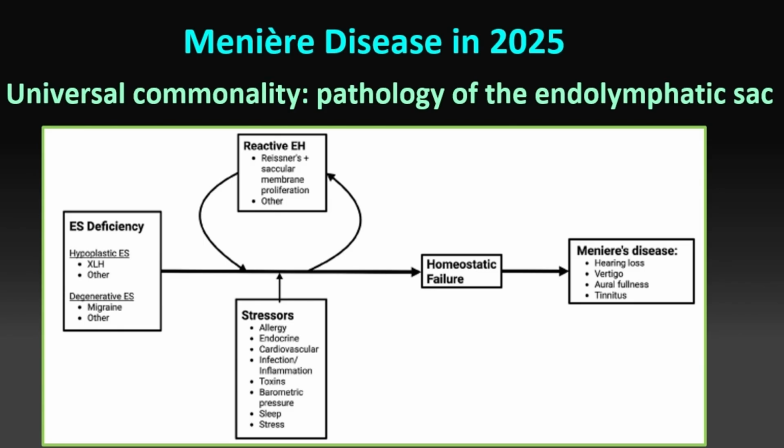Is it the endolymphatic sac hypoplasia type, or is it the endolymphatic sac degenerative type? So that's now how we diagnose Meniere's and give a little bit more about the underlying phenotype on imaging at AJNR. So we do MRI to look at the hydrops, and we also look at CT to look at the orientation of the vestibular aqueduct to give some idea of the underlying endotype and phenotype, because that has prognostic implications.